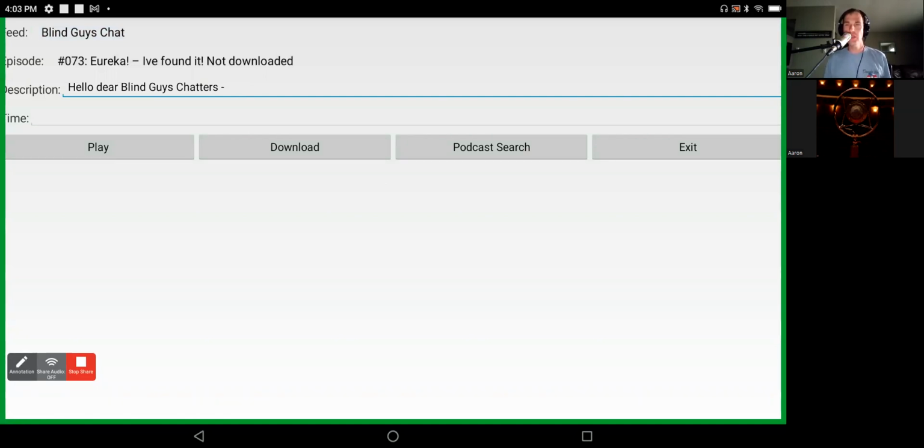So it gives me the ability to go through the show notes here in Braille and begin the show with some very sad news. Our friend. And then I can move through that as I wish. And I'm going to press F3 again. Download button. And I can download this podcast.